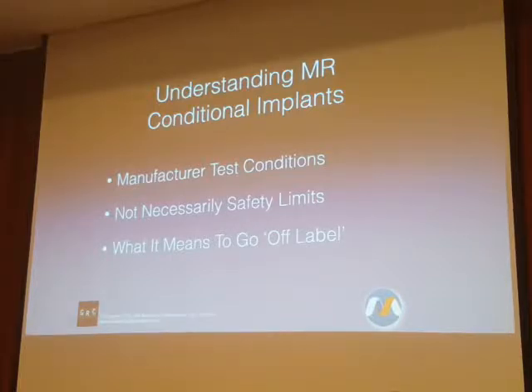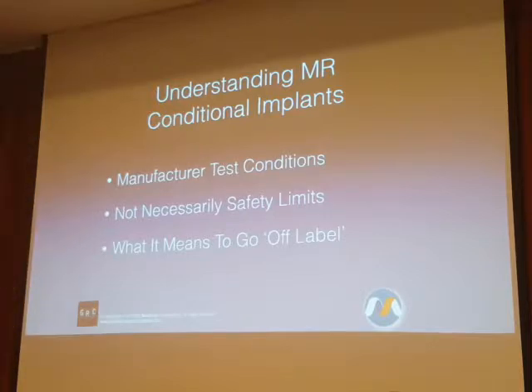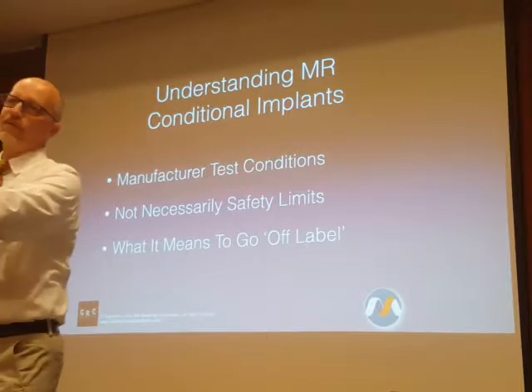So you look at the string, and as long as the string didn't deflect 45 degrees, if it deflects 45 degrees, that means that the amount of pull into the magnet is the same as the amount of gravitational pull towards the ground. The theory being that, well, the object or implant or device is constantly under one gravity of force that's pulling it down. So we know that if there's a 45-degree deflection and it's pulled with one gravity of force that direction, that's not more than it experiences being pulled this way all the time, so presumably that's safe. So 45 degree is the magic threshold.